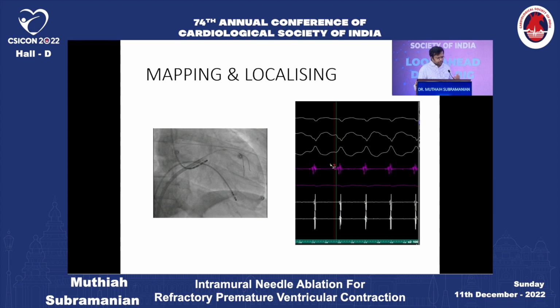Before you instill, usually we take, and I'll show you another picture of this, a 014 PTCA wire, and this wire can sometimes be used in a unipolar configuration. I'll show you that. You're able to get signals from your wire at the appropriate parts in the venous system. So this gives you somewhat of a surrogate for the local activation within the structures. Based on which vein your wire mapping shows the best signal, you target the same vein for alcohol ablation.